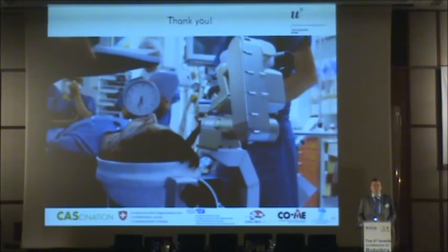And also the question of what happens with the slight distortions. As you can imagine, if you scan the patient, you get a stack of pictures that in the computer go together very nicely, perpendicular to each other and so on, but in reality, it's a mechanical system that records the images and it creates distortion and so on. So we need to cope with this. This is the challenge. Thank you.